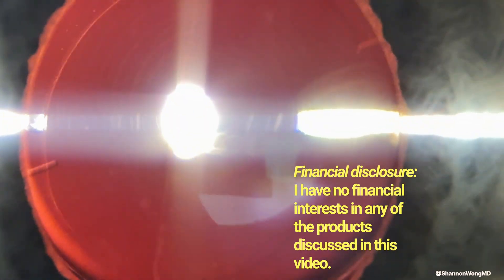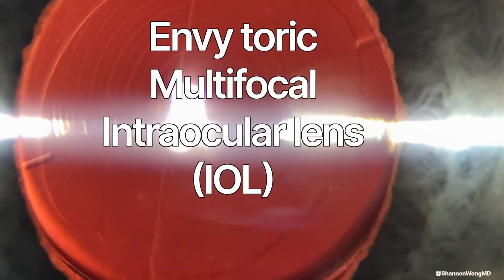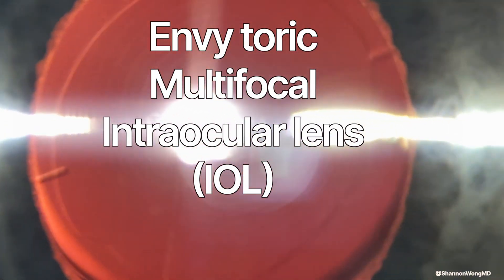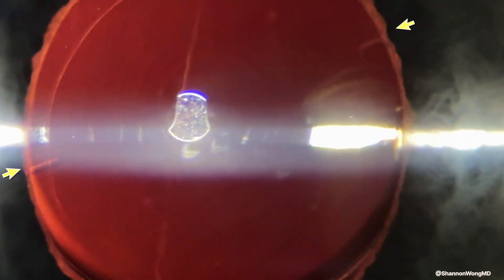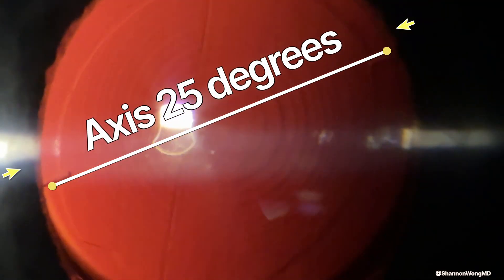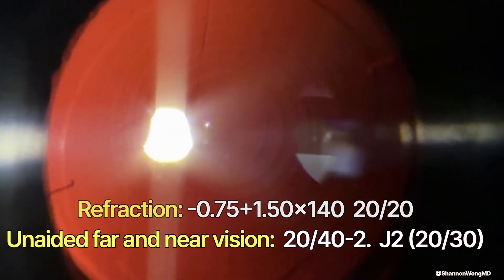This is an astigmatism correcting multifocal lens implant — specifically, the Envy Toric Multifocal Intraocular Lens, or IOL. There are alignment marks on this IOL. This lens is at axis 25 degrees. In this position, his refraction and vision are as follows.